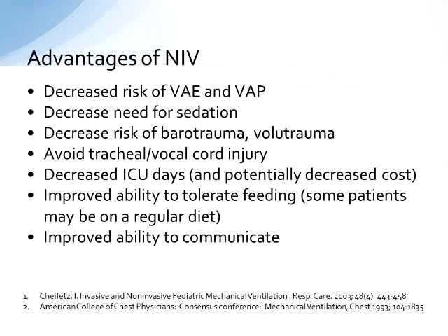So some of the advantages of non-invasive ventilation compared to invasive ventilation: you'll see a decreased risk of ventilator-associated events or ventilator-associated infections. Many patients on non-invasive ventilation have less pharmacologic need for sedation, and less risk of barotrauma and volutrauma associated with NIV. If you don't have an endotracheal tube, the likelihood of the damage caused by the tube obviously goes way down, so the risk of tracheal and vocal cord injury is lessened without an endotracheal tube.